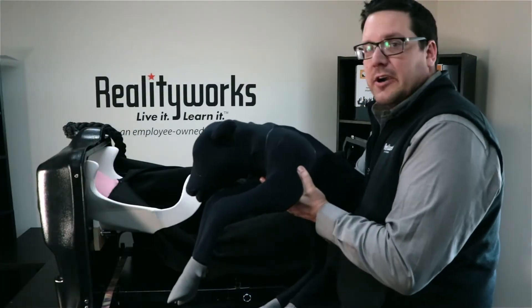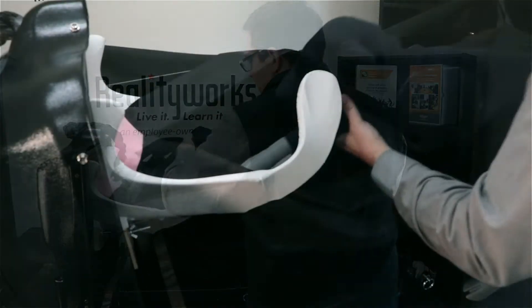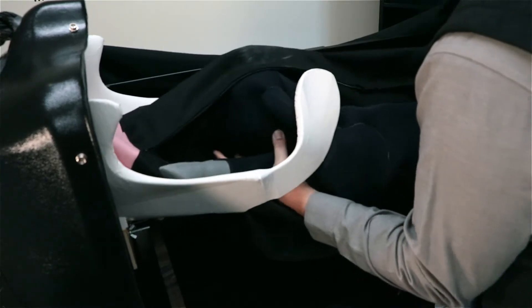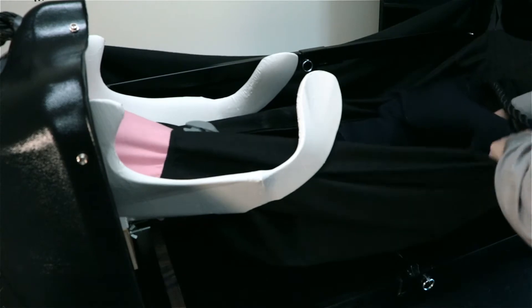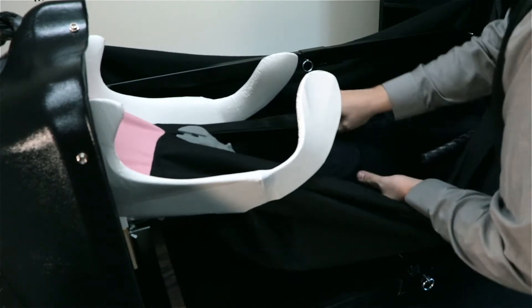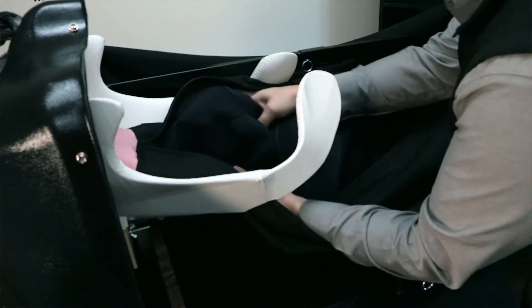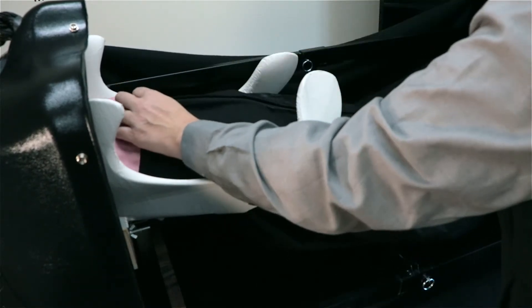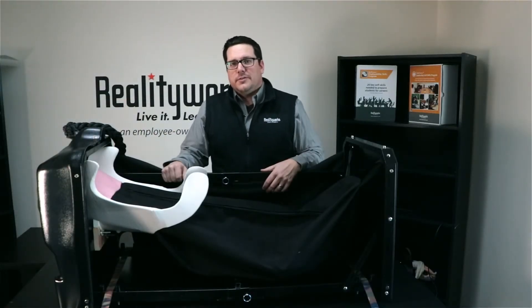We're going to put our calf into the birthing simulator. You can put the calf into the reproductive tract — this is a teaching tool for you and your students to put it inside and move it around to see what the positioning might be. There are a lot of different positions you can use, but we're going to use the normal standard position. Get it into place and it's now ready for the birthing process.